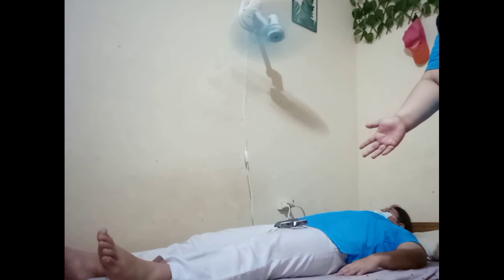For the patient position, ask the patient to do the lateral recumbent position with the affected side down. Instruct the patient, or assist the patient if necessary. Take note that you should not ask the patient to do this position if the patient has severe trauma, or just make sure that the patient will not have a hard time positioning.